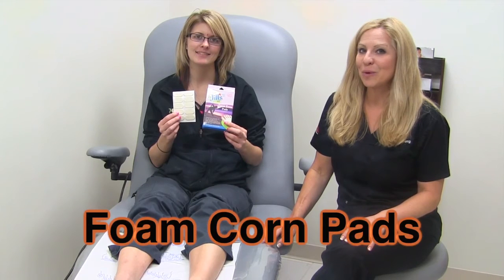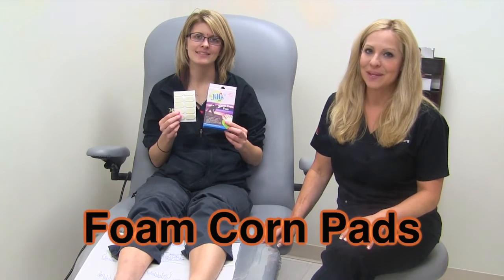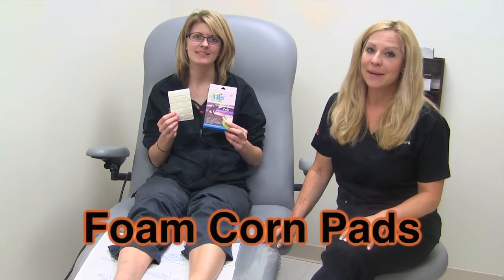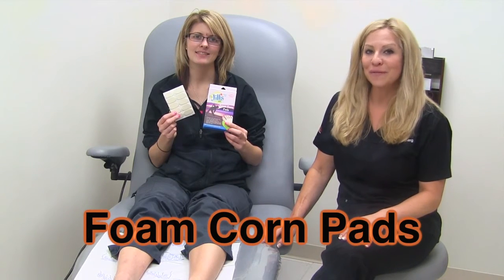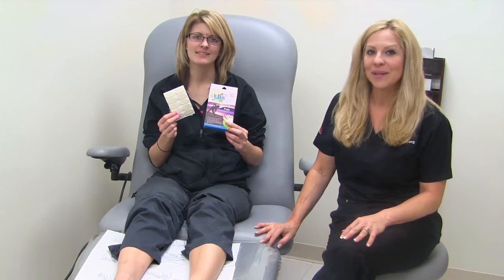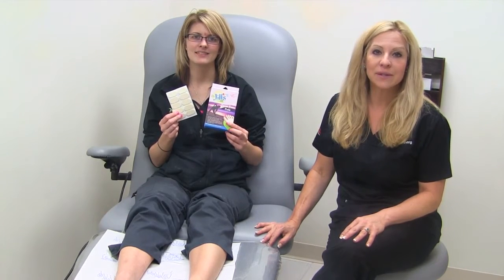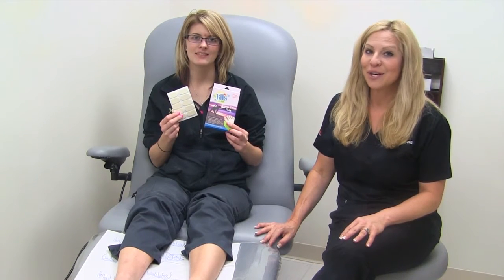Here we have the foam corn pads made by Dr. Jills. They comfortably stay in place when wearing socks or hosiery without taking up any shoe space. You can wear the foam corn pad in any shoe. This foam corn pad creates a barrier between your foot and the shoe to reduce pain. You can also use it for tender, bony prominences, hammer toes, and corns.